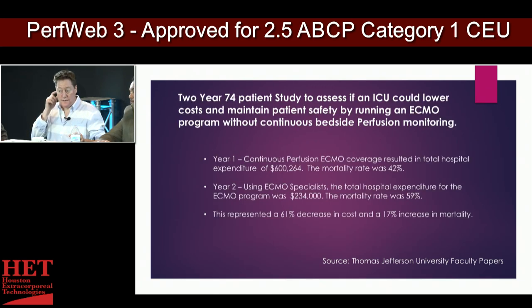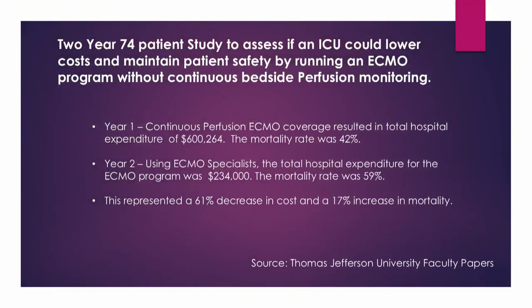So the first year, they ended up billing $600,000 for their services, and that involved setting up the ECMO circuit, 24-hour coverage, and just everything that was involved with ECMO. There was nobody else involved, just the perfusionist, which is what we do as a business. It can be taxing on the perfusion. It's horribly taxing on the staff. It's stressful, especially when you have multiple ECMOs in multiple hospitals.